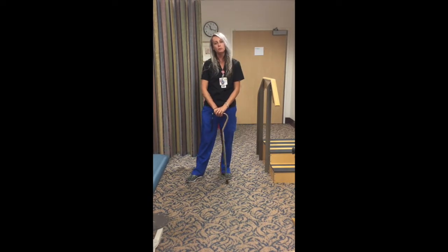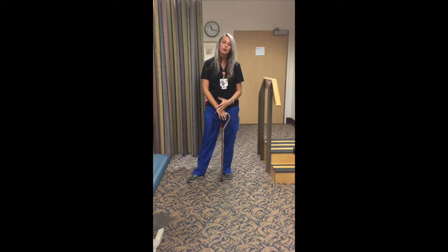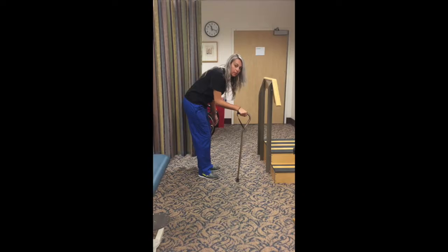Is there a priority? Do you want to match the hip height or do you want to match the arm height? We're looking more for arm height. We want to have that 30-degree bend in the elbow. And it's typically at the level of the wrist? Generally speaking, yeah. You don't want to be holding the cane way up here, but if it's too far, then you end up bending over and we don't want that.